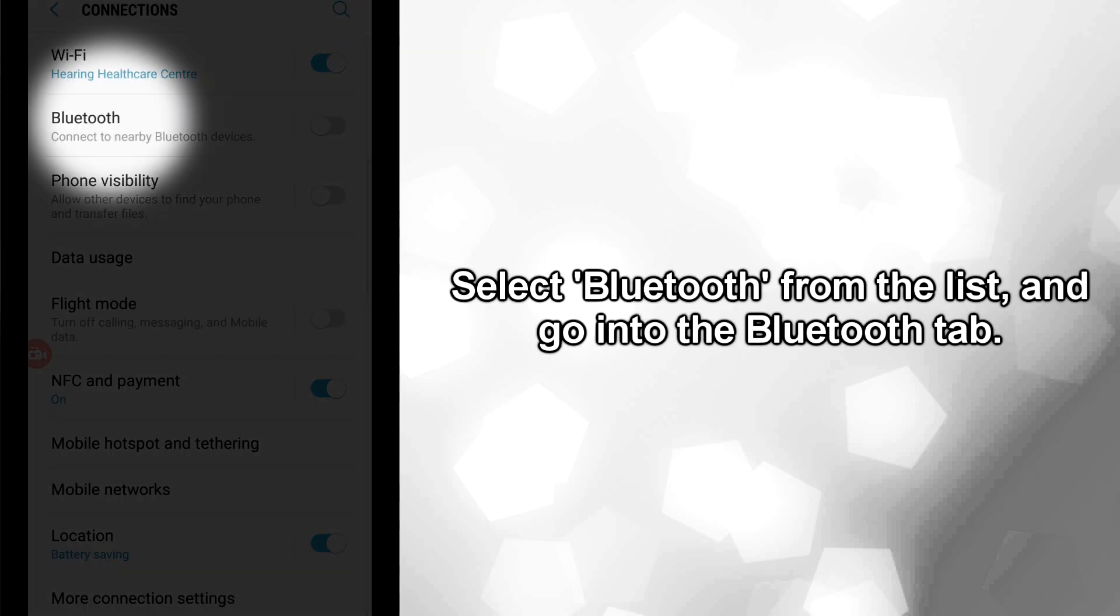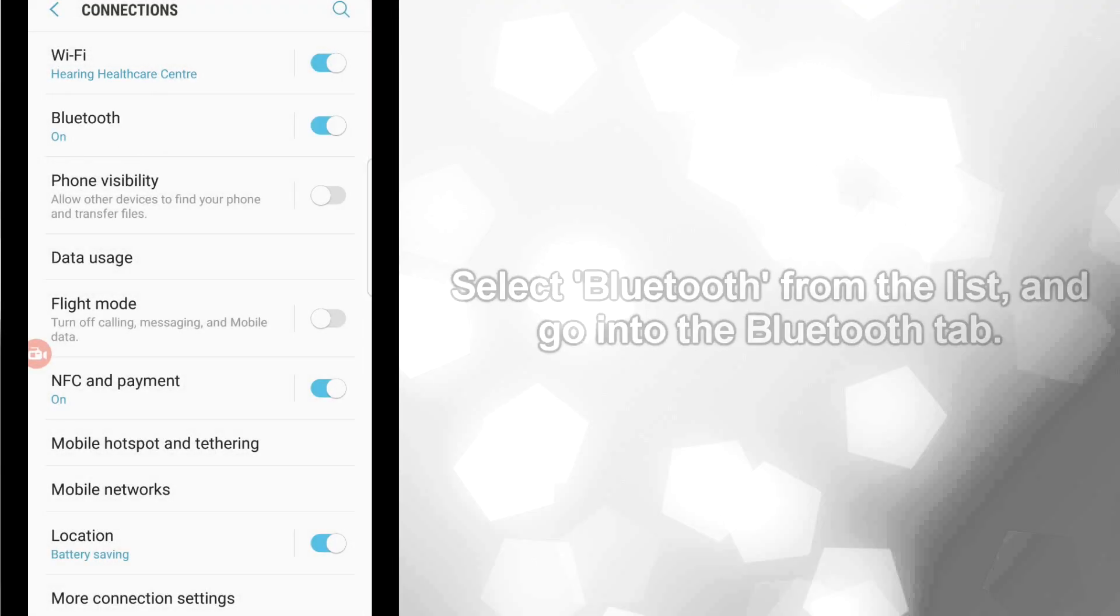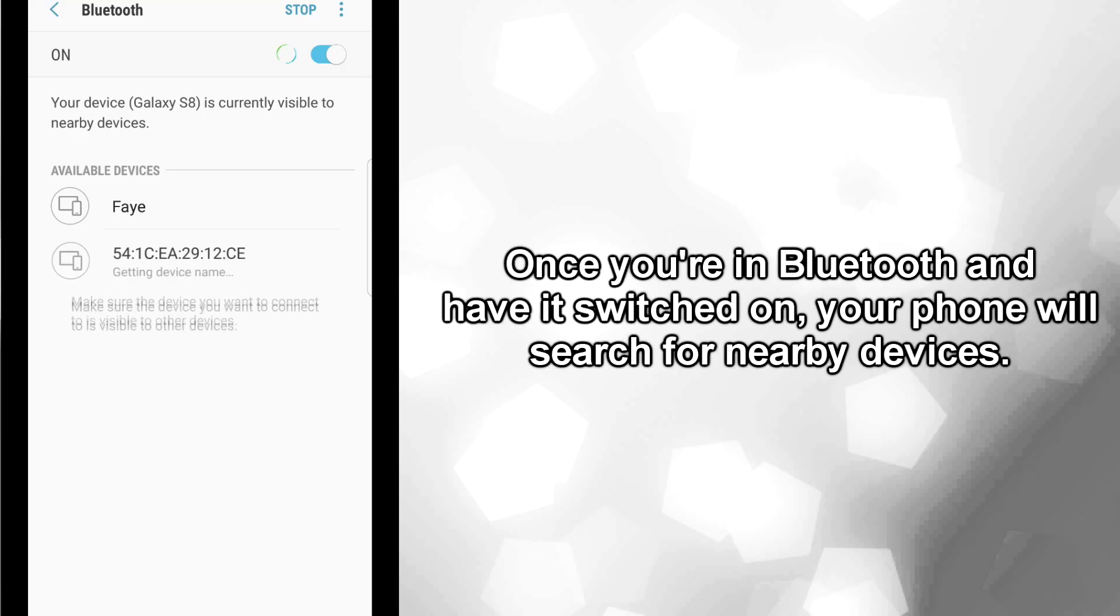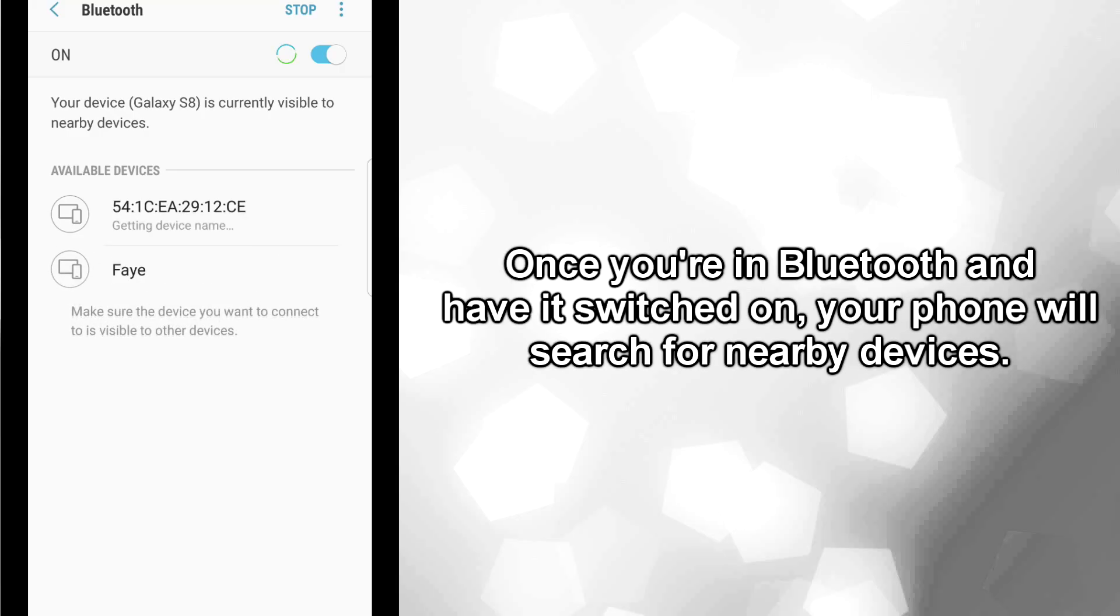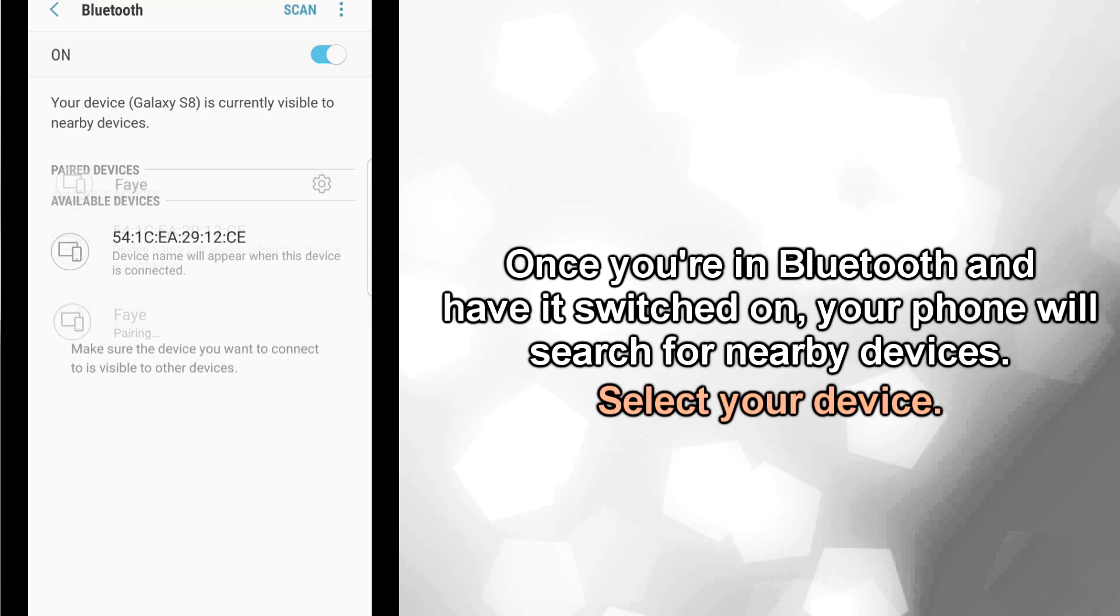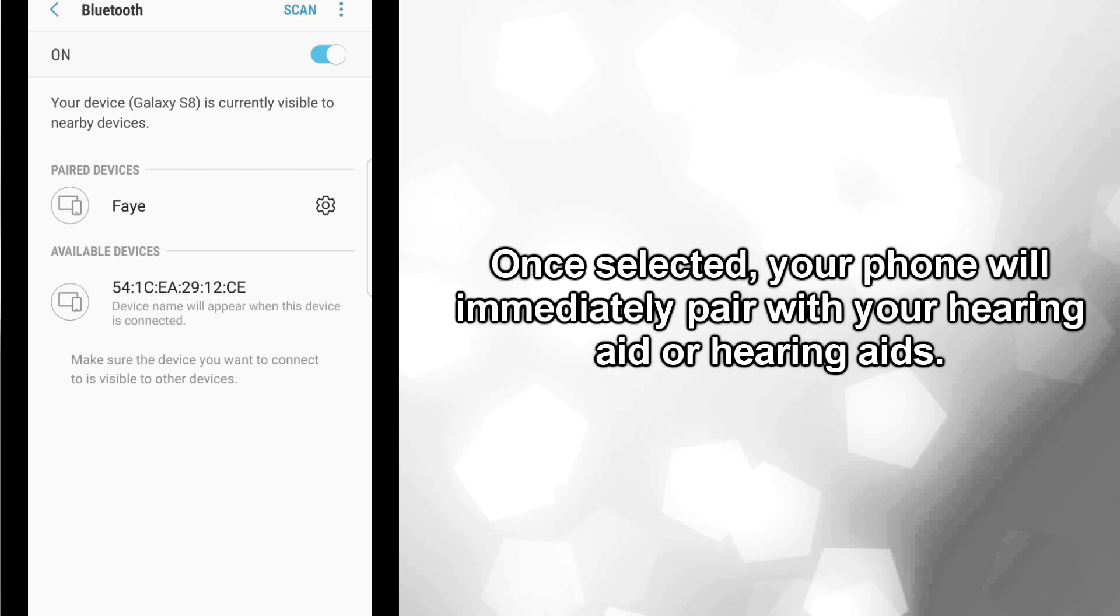Select Bluetooth from the list and go into the Bluetooth tab. Once you're in Bluetooth and have it switched on, your phone will search for nearby devices. Select your device. Once selected, your phone will immediately pair with your hearing aid or hearing aids.